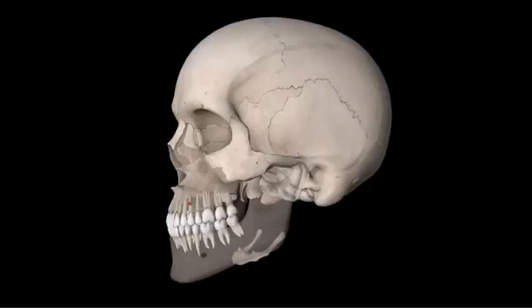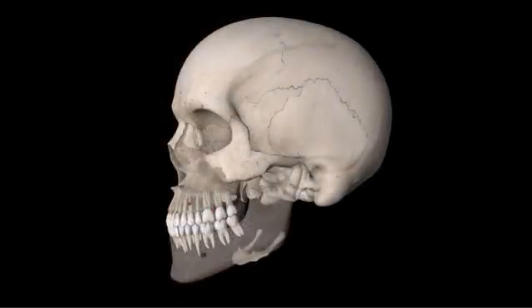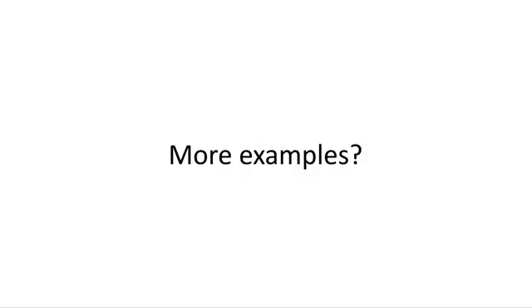Let us visualize this in 3D. Here is our base image, and as we move more mesial, showing more anterior teeth, the buccal side is going away from us and the palatal or the lingual are coming towards us. Do you see this? Let's repeat this again. Okay, now the concept has been explained and we know the SLOB rule applies in all aspects of dentistry.